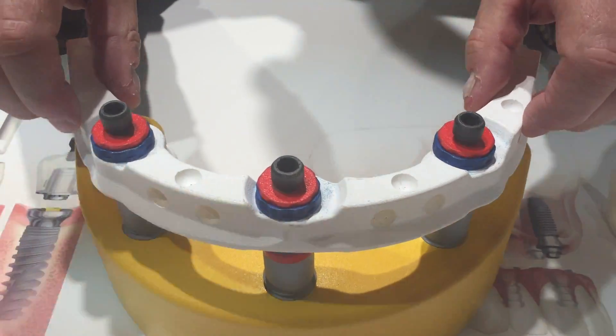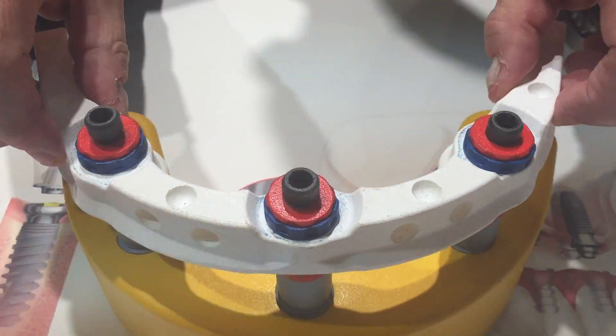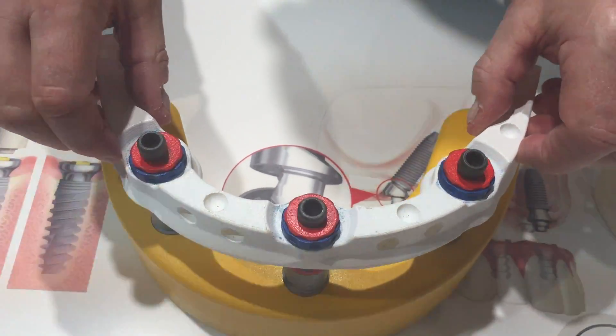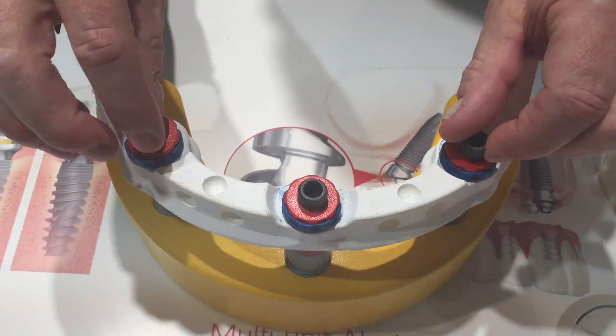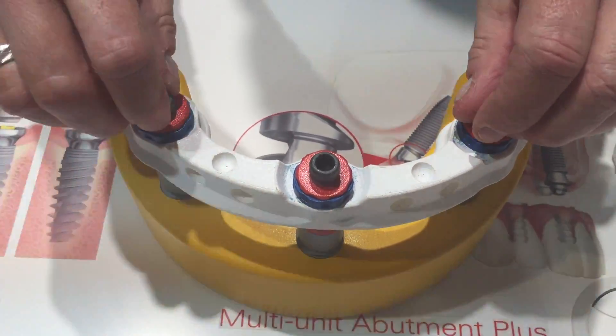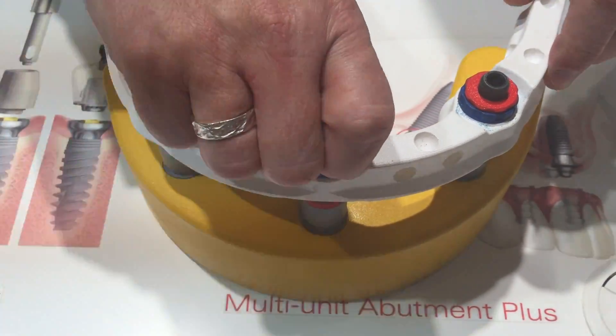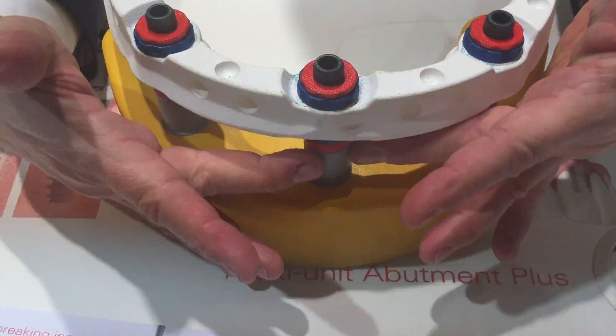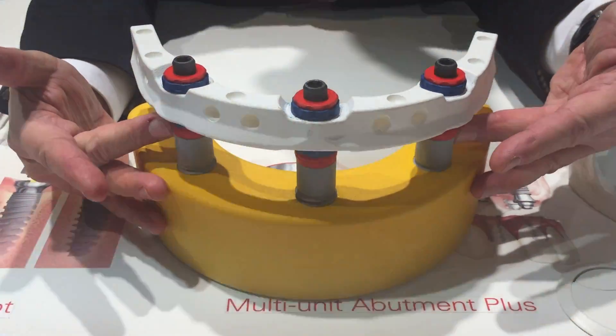As you can see here, this is completely open to move in all those directions. And the technician has to adjust this compensation mechanism by tightening up all the three screws and to verify if there is a passive fit seated on the implant.